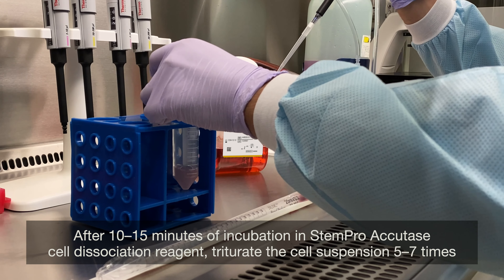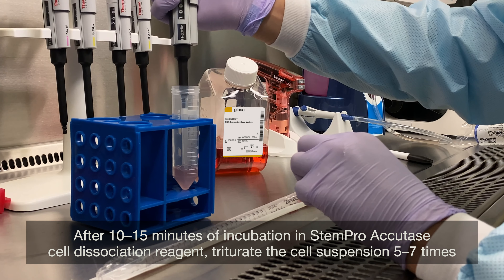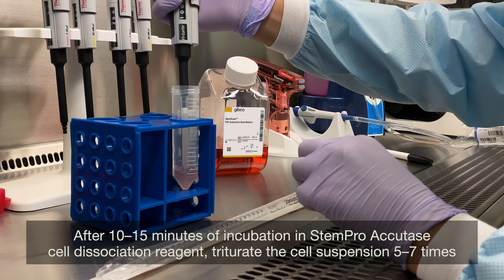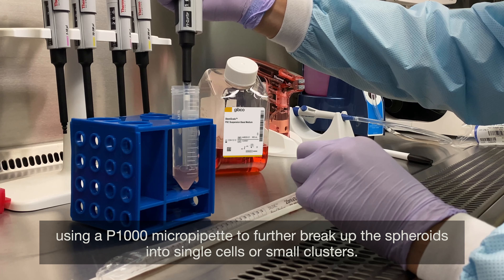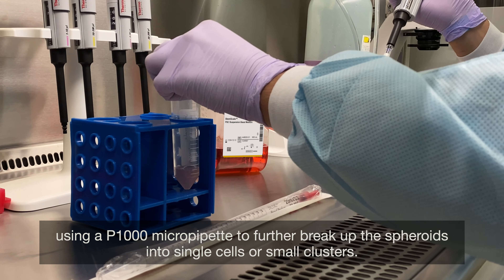After 10 to 15 minutes of incubation in StemPro Accutase Cell Dissociation Reagent, triturate the cell suspension 5 to 7 times using a P1000 micropipet to further break up the spheroids into single cells or small clusters.